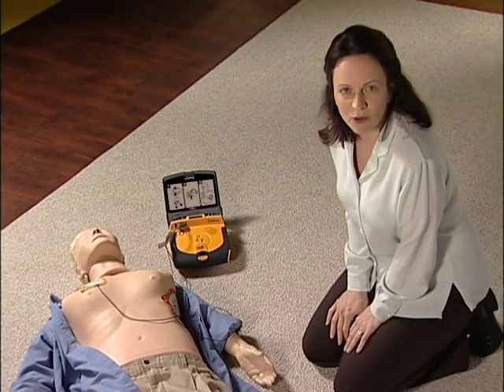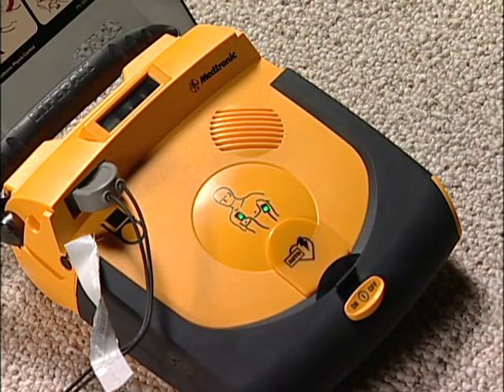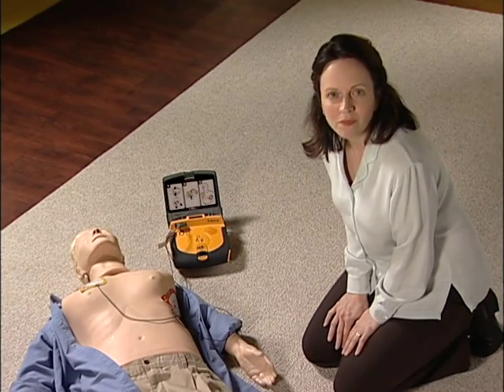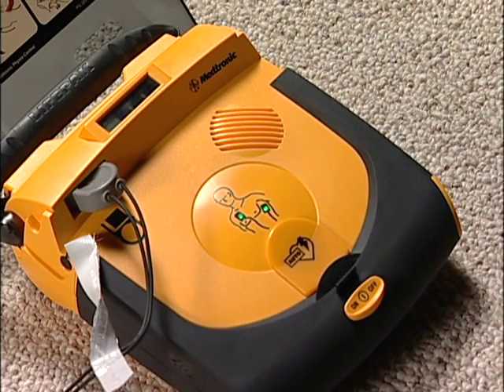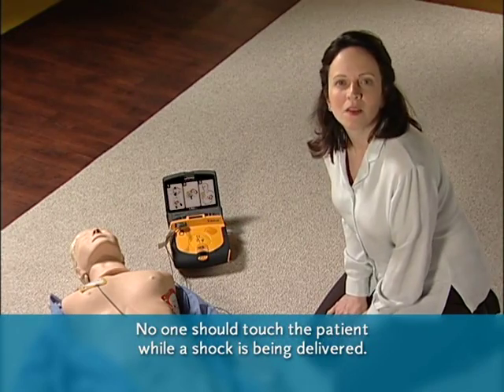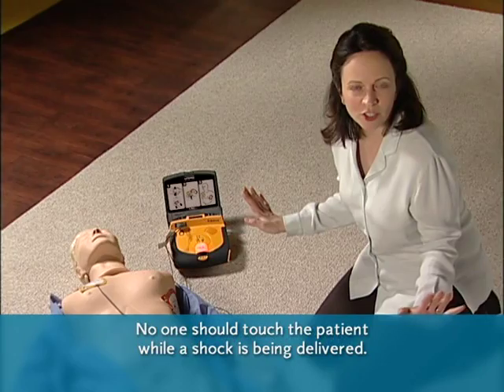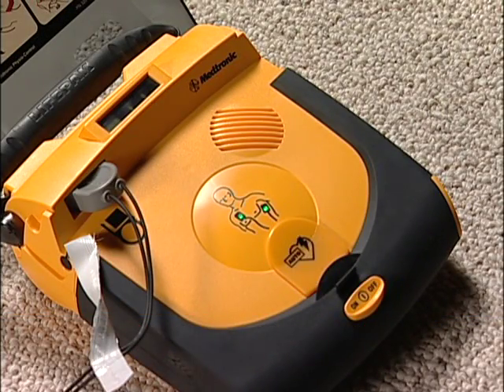If it detects a heart rhythm that needs a shock, it will say, Stand by. Preparing to shock. It charges automatically. Wait until it says, Everyone clear. Do not touch patient. Delivering shock. Make sure no one is touching the patient. Shock delivered. Provide chest compressions and rescue breaths.